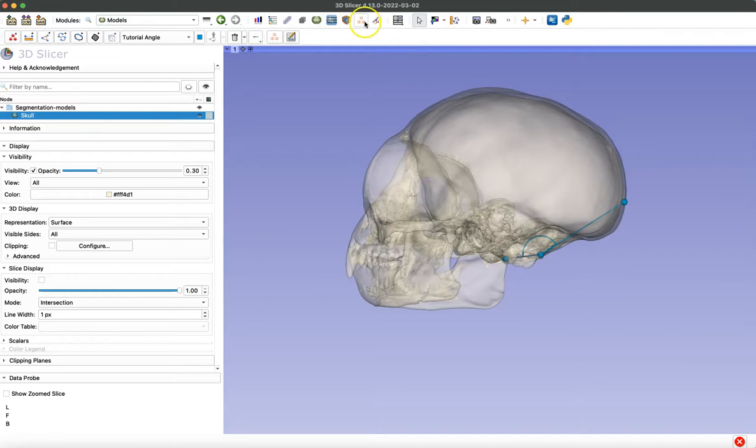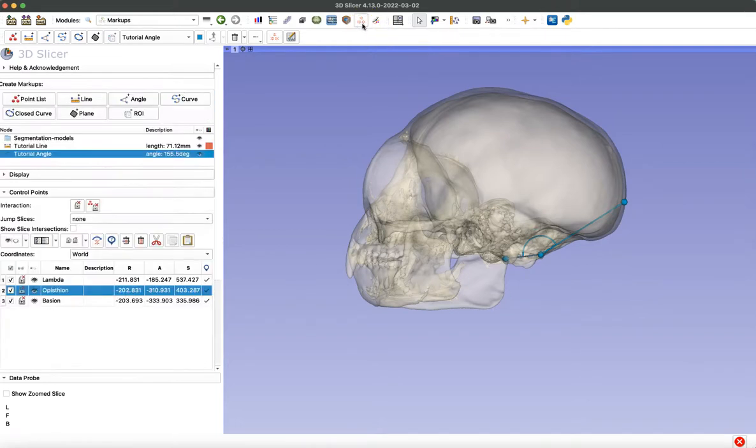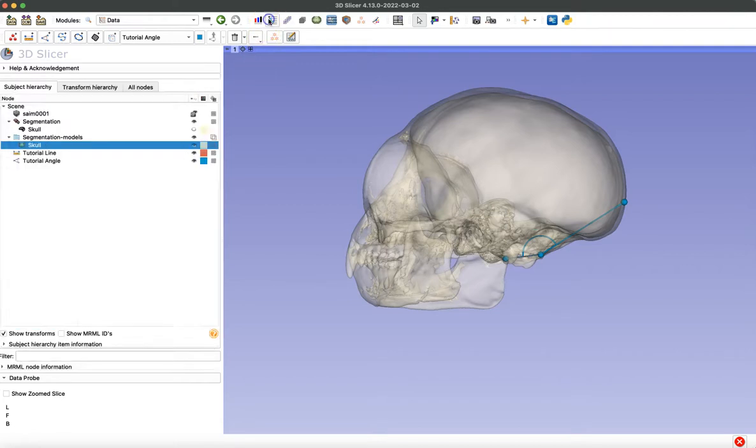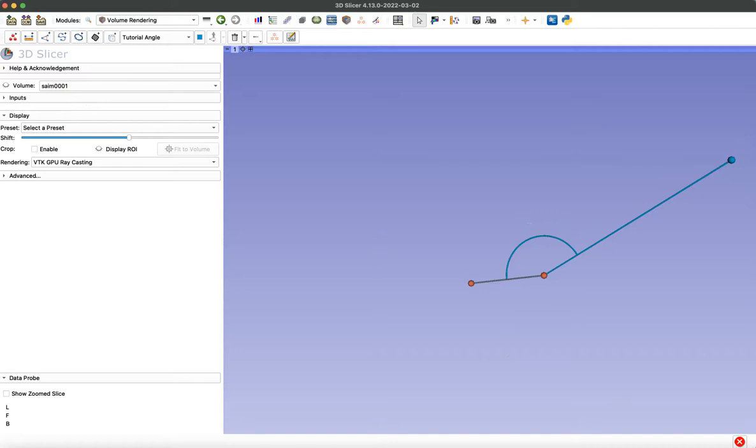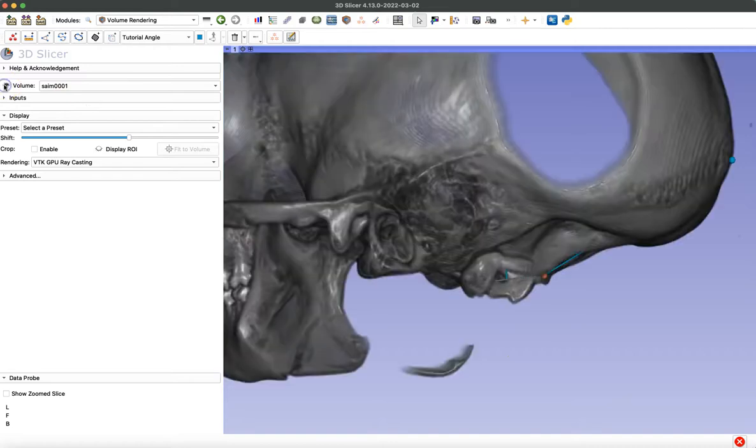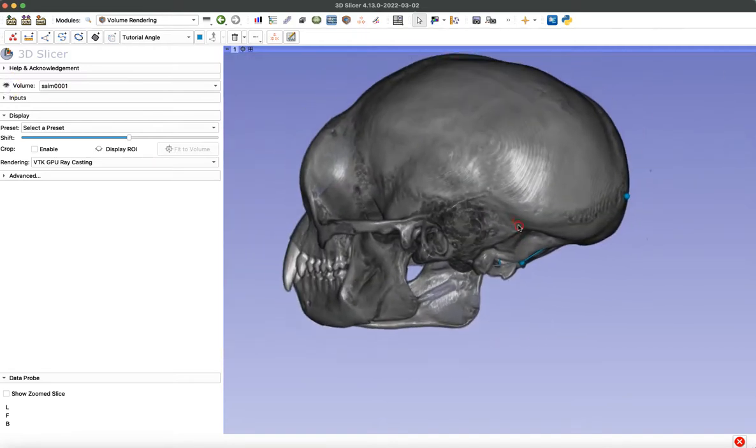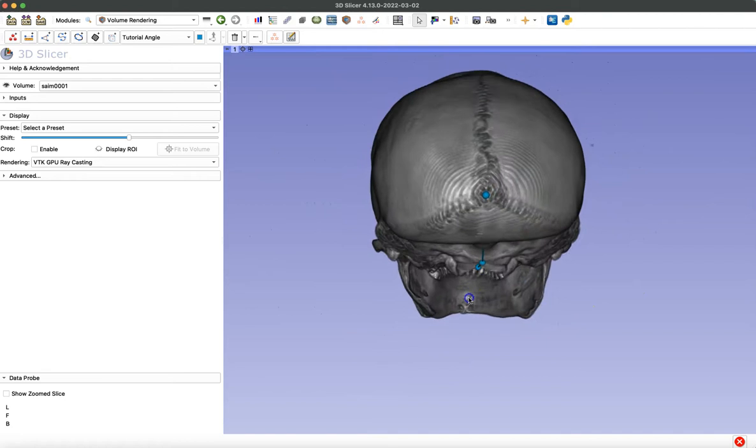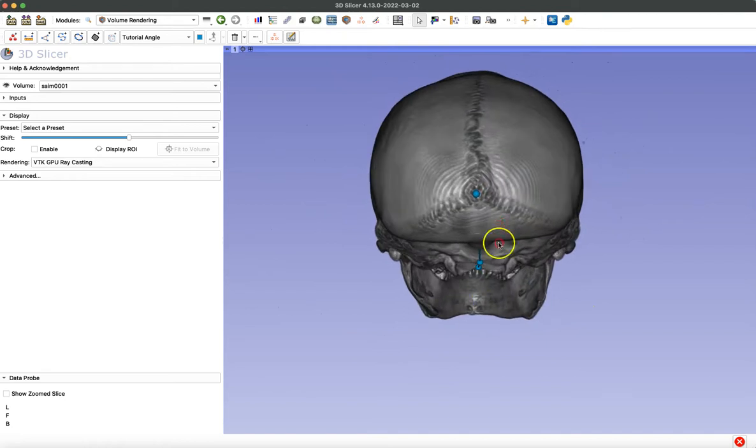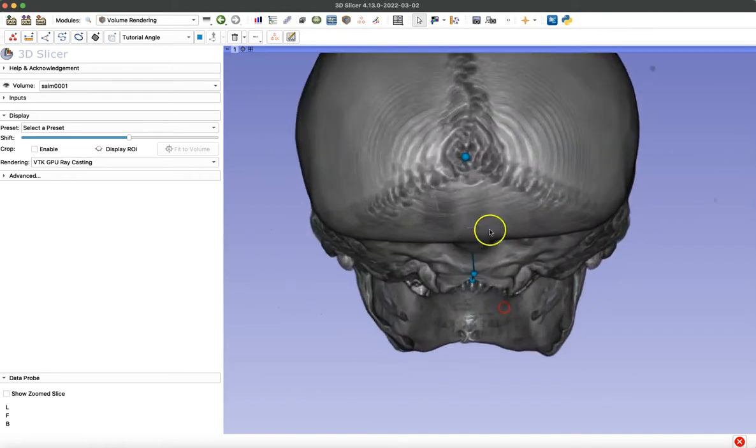So if we navigate back to the markups module, we can see our final measurements here for our angle and our length. And our angle is 155.5 degrees. So before we finish, I have one final tip to show you. And that's just to really use the volume rendering module when you're placing points, especially on sutures. The visibility is way better. And as you can see, those sutures are much clearer, much darker than on that segmented model we were placing our points on before.